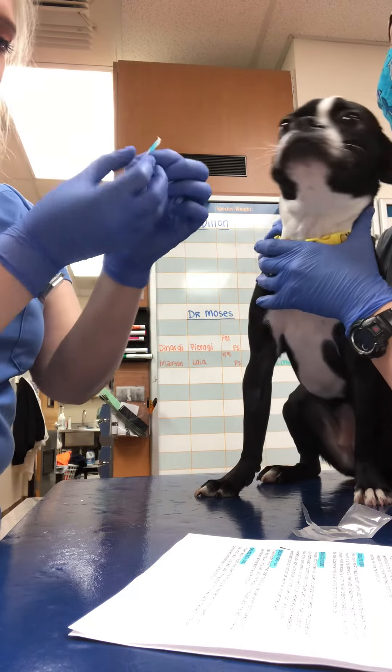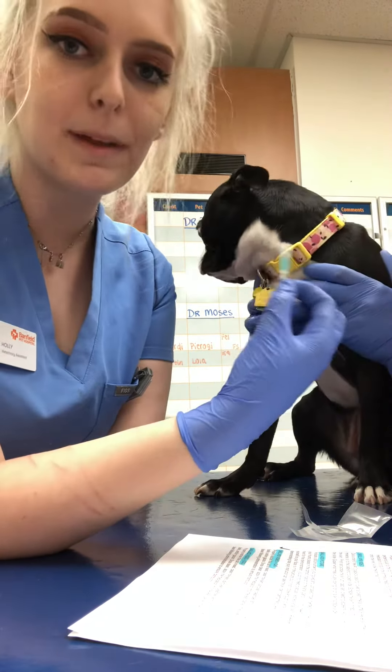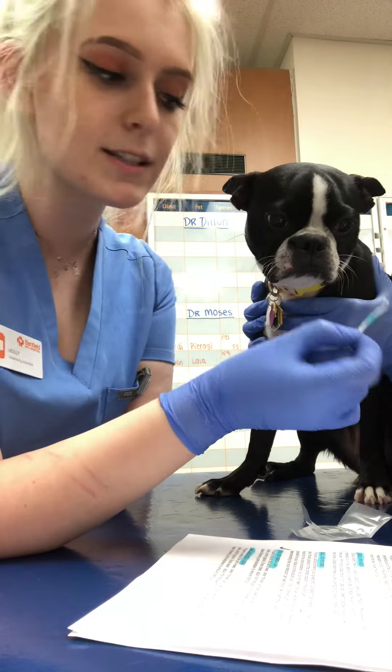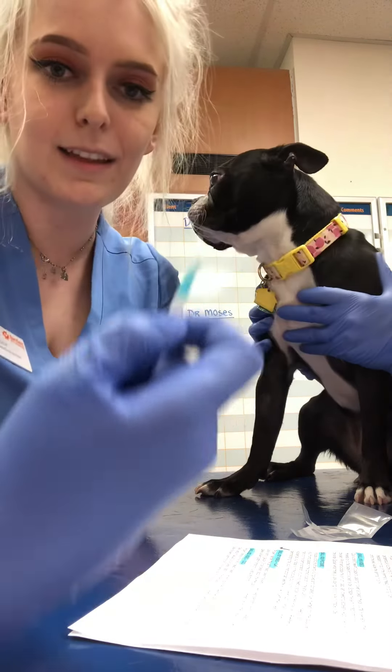According to the strip, Lola's tear test level is at 21mm. I can record this in her file as 21mm on the Schirmer Tear Test. It would be recorded as OS, as this was performed in her left eye. And that is what it looks like.